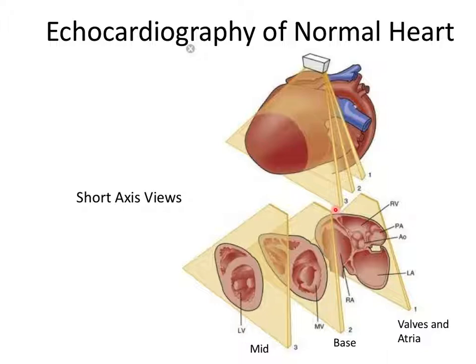Or the patient has 4 inches of adipose tissue between their skin and their ribs, right? So they're big. If their BMI is 30, the person's like 5'10" and weighs 300 pounds, you have a long distance between where your transducer is sitting on the chest wall and the ribs.